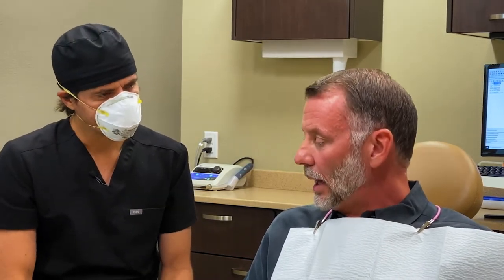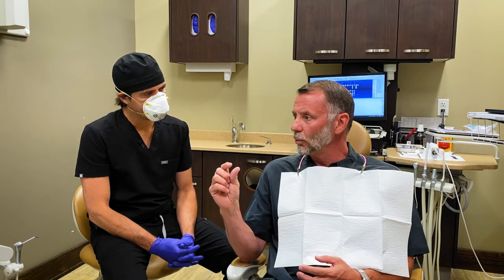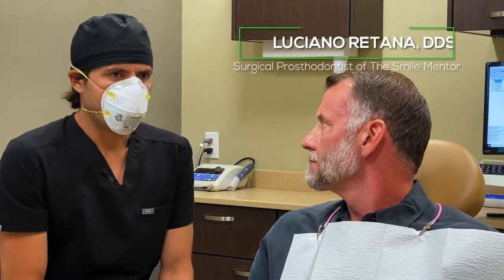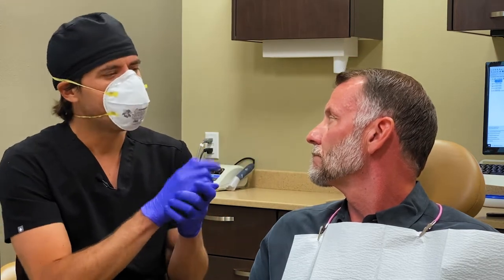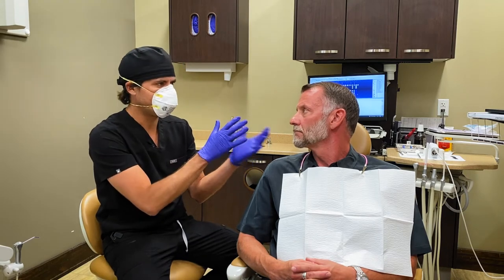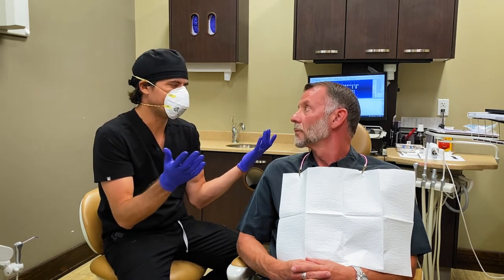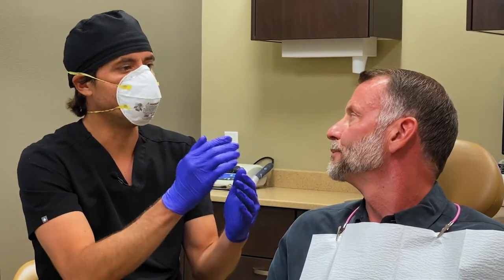So aside from the brightness — it's pretty bright — when do we get to the shade side of things for the final restoration? Because this doesn't help with shade, and I see the white so strong when compared to my lower teeth. Today we're going to do what we call the custom shade, where we're going to take pictures of your gum and use this shade guide. This trial PMMA is printed in one shade, that's why it's very bright, but we don't care too much about that because it's only for 10 days.